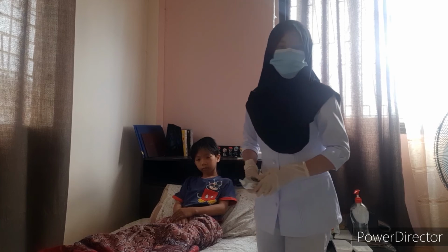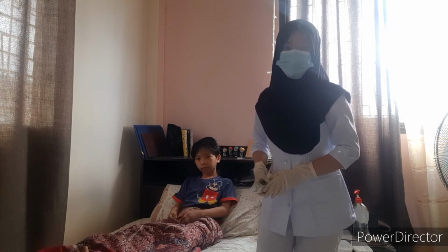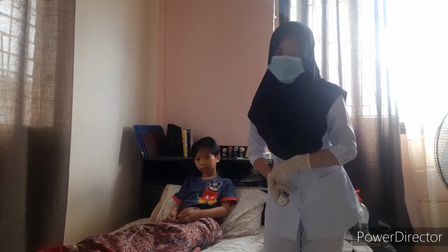We have to ensure that the probe of the thermometer is properly inserted into the ear to allow the optimal reading, and there is no need to touch the eardrum with the tip because the thermometer is designed to take a remote reading. So the proper positioning of the probe provides an accurate reading.